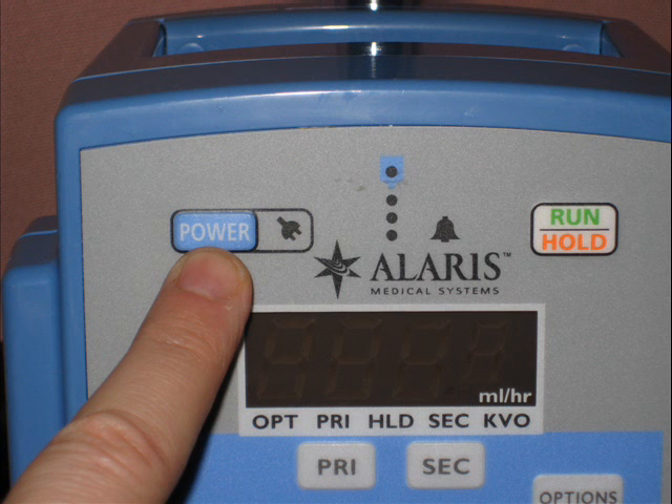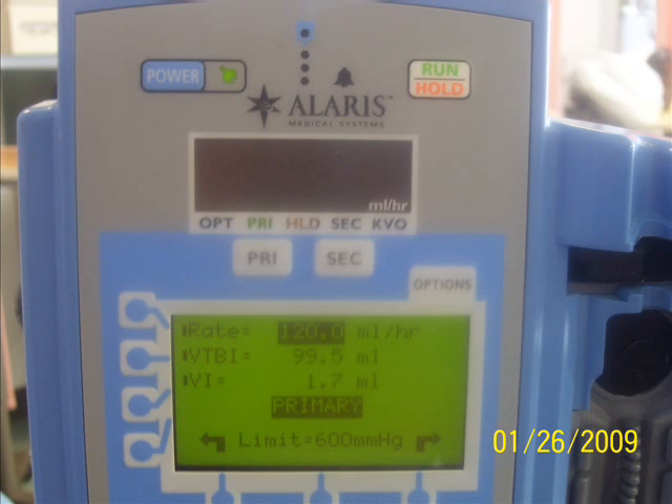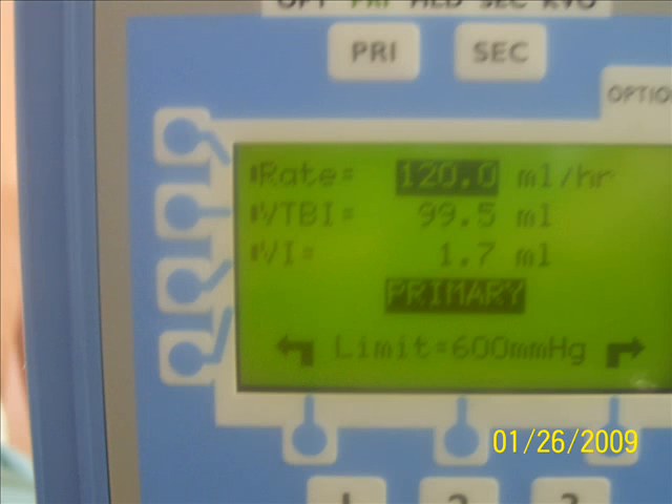We first have to power it up and have it powered on before we can do anything else. For this exercise we can set up the rate and volume to be infused by pushing the buttons with the numbers and hitting enter after that.